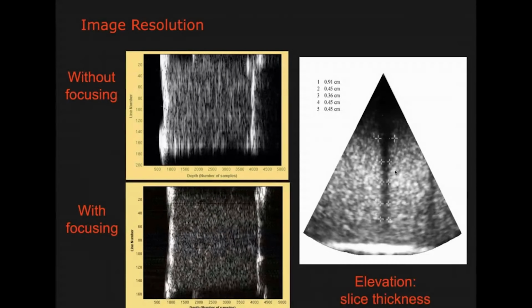So ultrasound in the direction of the propagation of the ultrasound pulse, so in the direction of the scan lines, it's in the order of micrometers in resolution. Lateral direction is more close to millimeter. Plane direction can be close to centimeter almost. So we see it's very, very anisotropic. So that means that while it looks like these images are not always that nice of resolution, you have to keep in mind that the resolution really depends on what you're looking at, in which direction in the image that you're actually looking at.